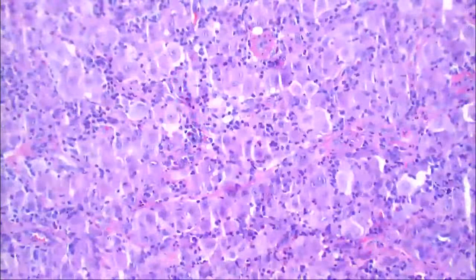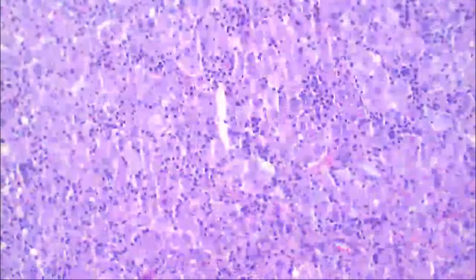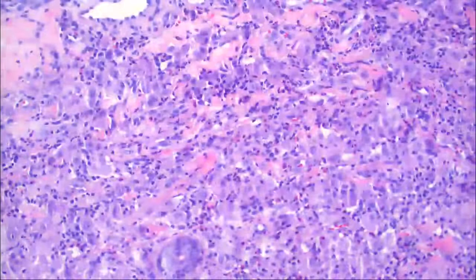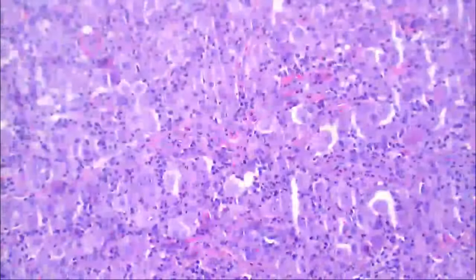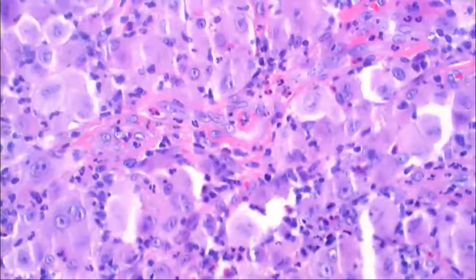On review, I thought that maybe these were histiocytes. I thought maybe they were replicating in areas, and they were multinucleated. And then there's some surrounding inflammatory component also. Yeah, there are some neutrophils and some eosinophils. So what was your ultimate diagnosis? I settled in the end on reticulohistiocytic granuloma.